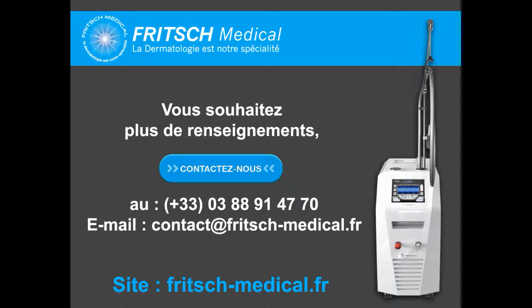It could be gray. You have some gray or brown, more contrast just after the shot. Okay, and you have some crust during a few days. So for the dark spot, you can treat and repeat maybe 1, 2, or 3 shots in the same session. And sometimes I prefer to cumulate 3 shots with a low setting than only 1 with a high fluence, because the risk is to inflame too much under the dark spot and to have inflammation during few weeks, and patient will be unhappy.